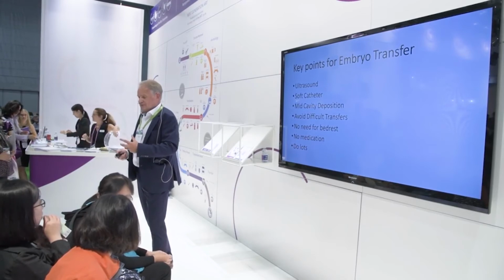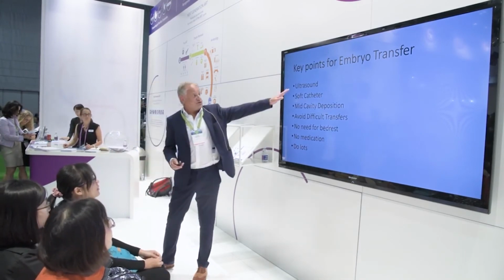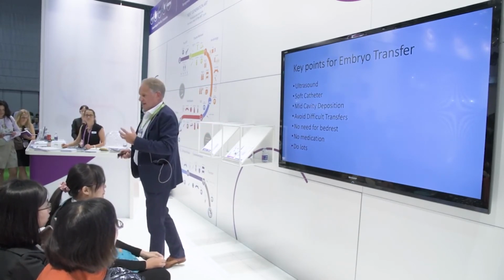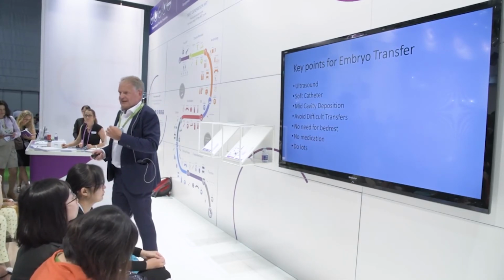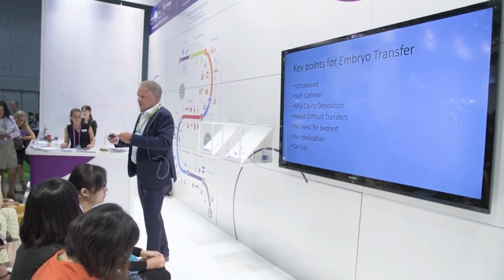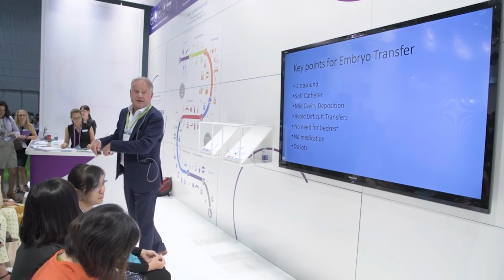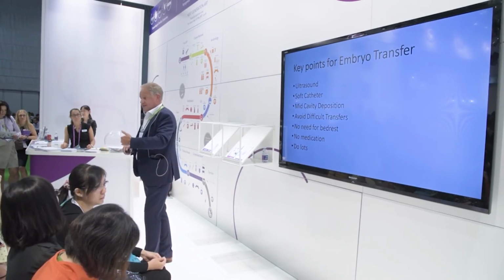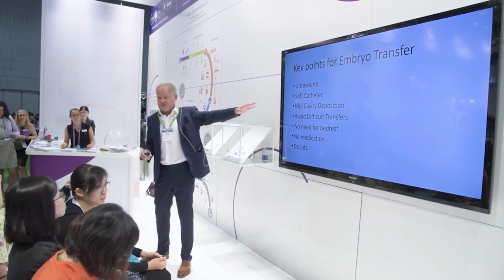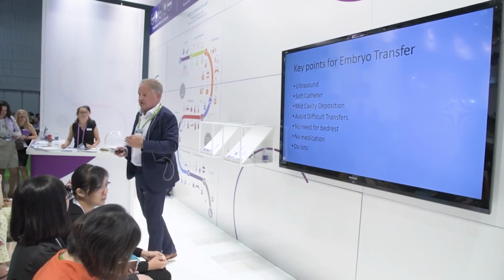So, what are the key points for embryo transfer? If you'd have asked me 10 years ago, I would not have said that ultrasound was important. I would have said that the important thing is experience. And we had this technique that we called the blind approach, or the feel approach. If you're eating your dinner, you would look at your dinner and cut it up with your knife and fork. You wouldn't look at a screen. But the meta-analyses and the randomized controlled trials have suggested now there's a strong evidence base that you can get better outcomes by utilising ultrasound to transfer embryos.